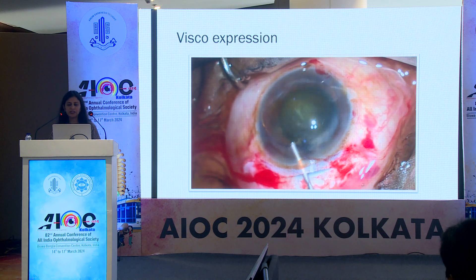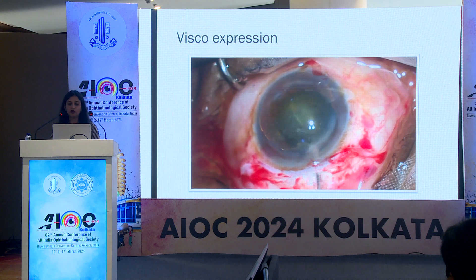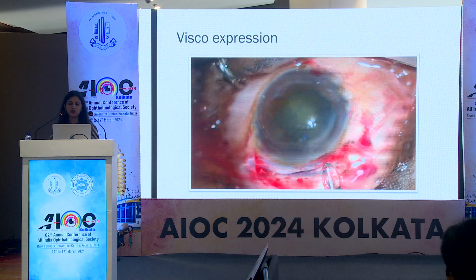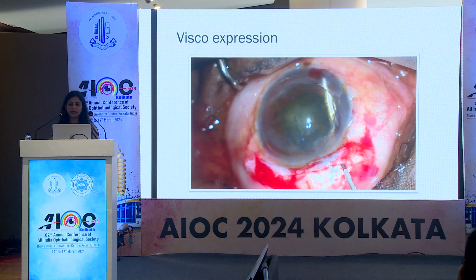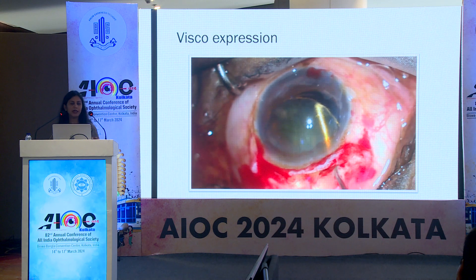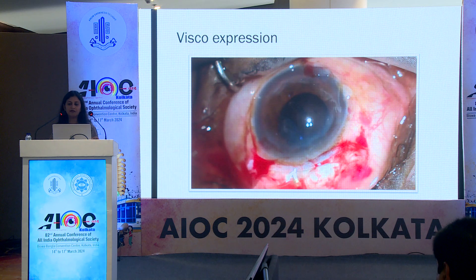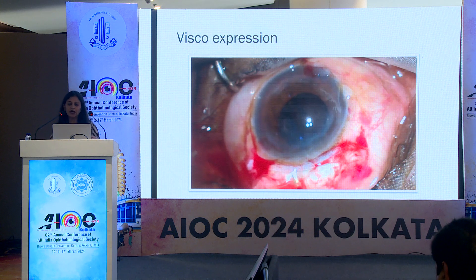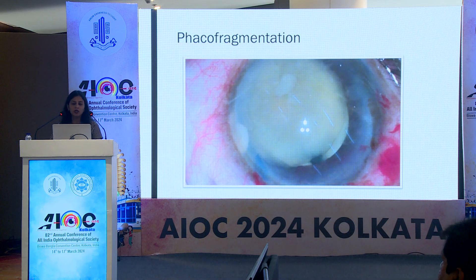Visco expression is practiced very commonly. The anterior chamber is filled with OVDs and the superior rectus bridle suture is tightened. The curved visco cannula is inserted under the nucleus so that the tip of the cannula appears over the iris at around 6 o'clock position. OVD is then injected and simultaneously the floor of the tunnel is depressed with the cannula itself. Along with the OVD, the nucleus comes out very easily.